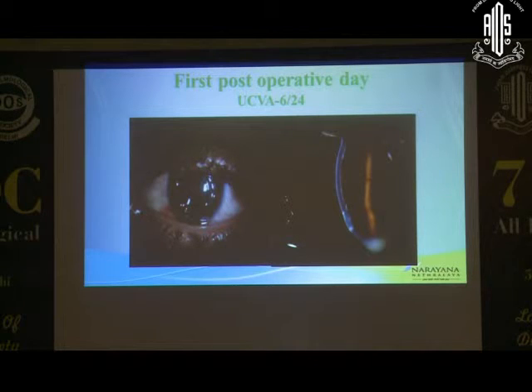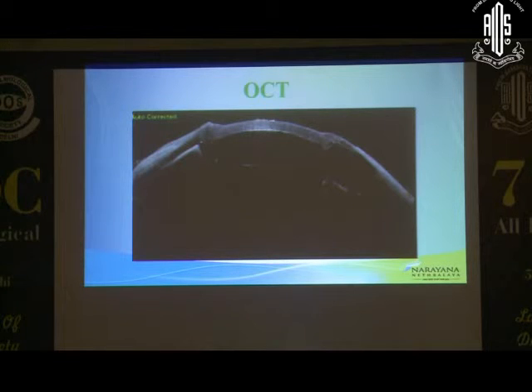And this is the first post-operative day, and look at the cornea, pretty clear, except I'm not sure if you're able to visualize the area of perforation, which is quite sealed now, and the profile view shows the clear cornea, and we've succeeded in proceeding with the lamellar keratoplasty itself, and unaided visual acuity 6/24. This is the OCT picture, which shows a clear cornea, and most importantly an adhered cornea.